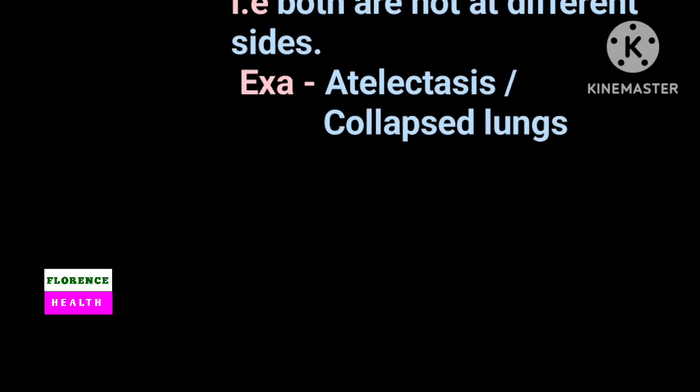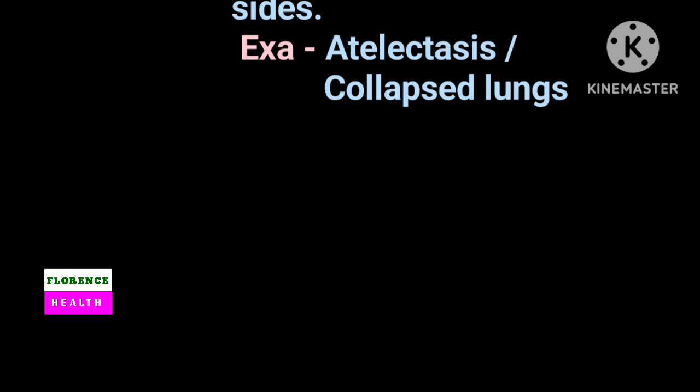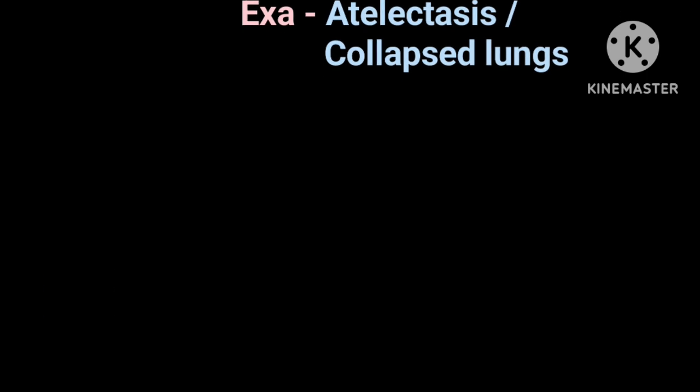Remember, push effect is due to tumor mass, pleural effusion, pneumothorax. Pull effect is due to atelectasis or collapsed lung. On comparison, pneumothorax pushes the trachea to the other side more than pleural effusion.